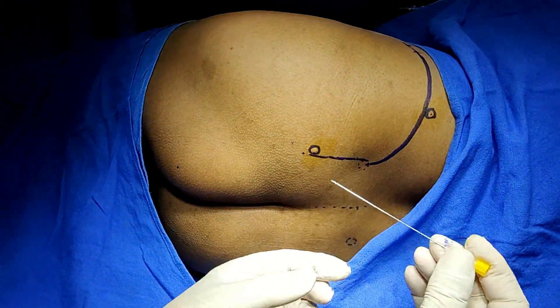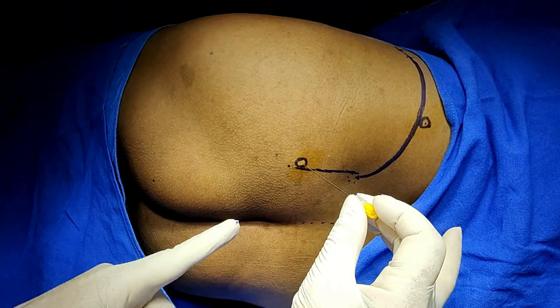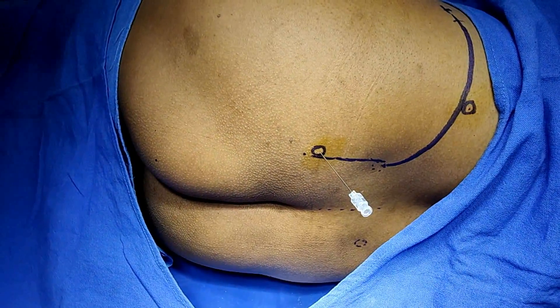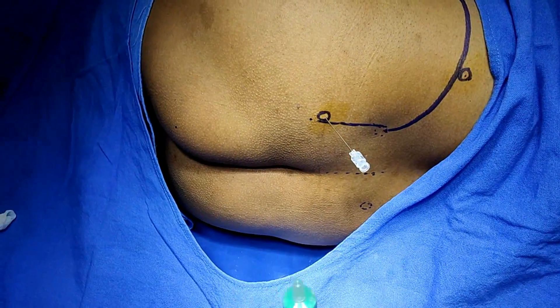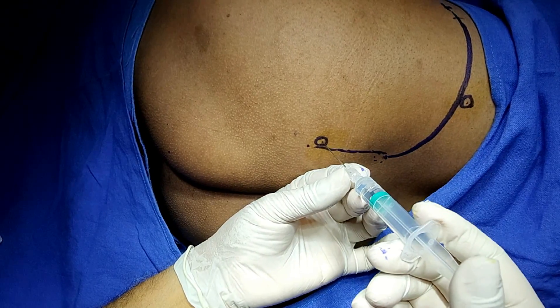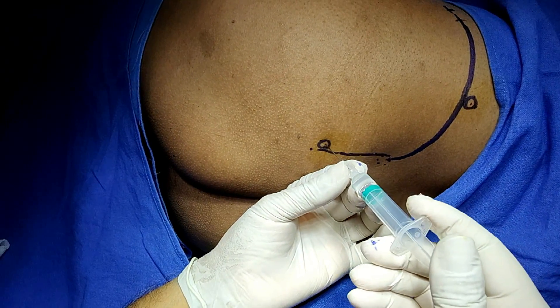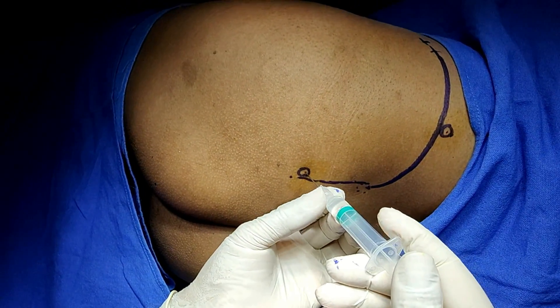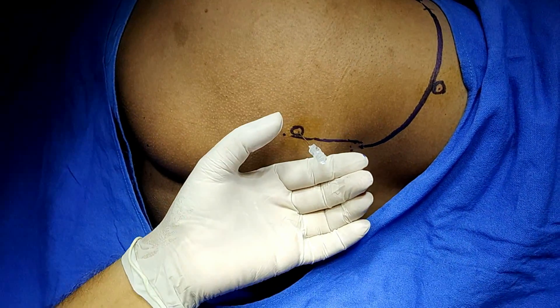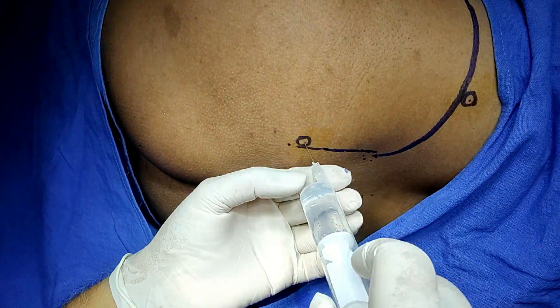For the sacral plexus block, insert the needle from this point in a downward and outward direction — this area is already anesthetized. Just puncture the skin. The needle is directed down and out. There is no resistance and the fluid is coming — connect the syringe here, aspirate, and inject 20 ml of solution.